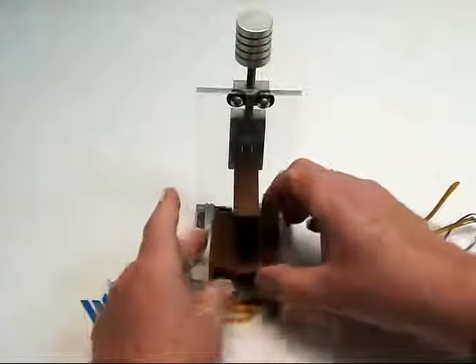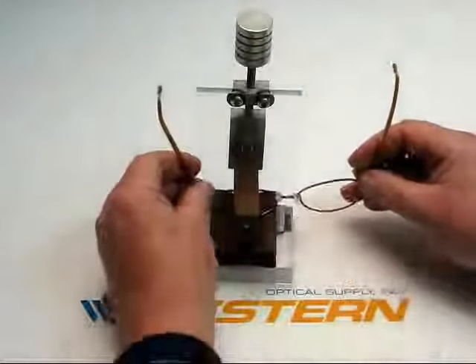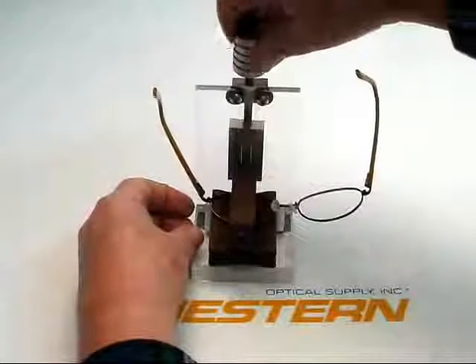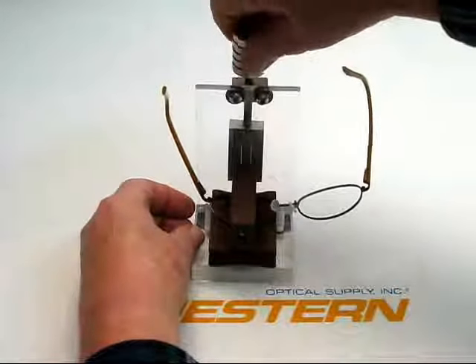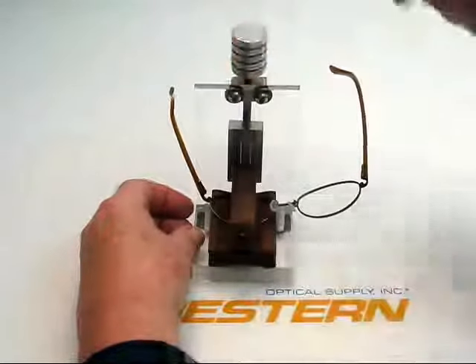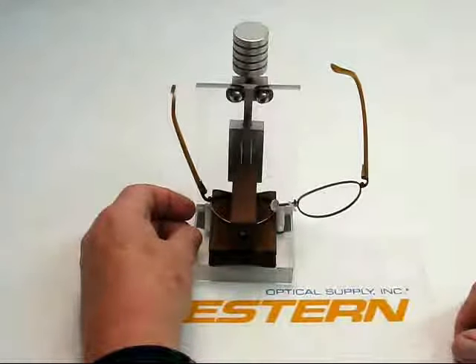And it's a press — easy to use. Match up your base curves, insert your eye wire, and simply screw down and watch the eye wire bend to conform to the base curve you've selected. That's the eye wire forming press.